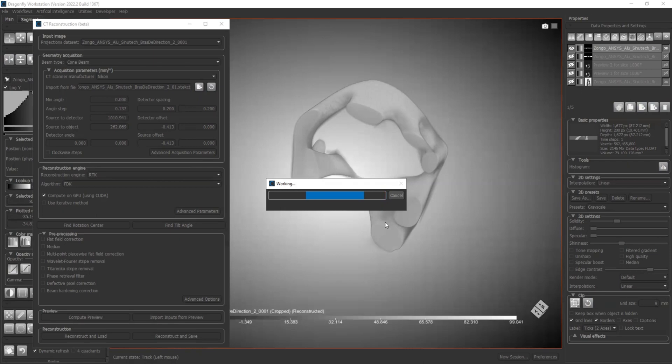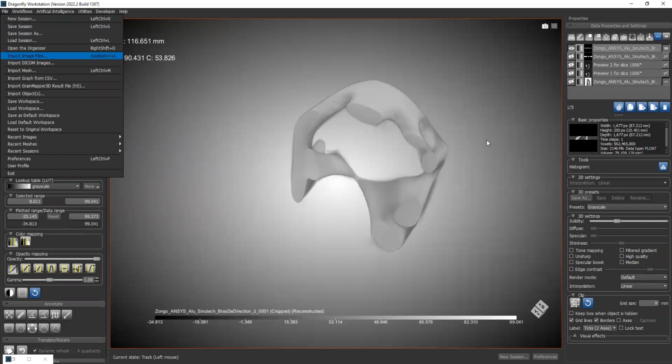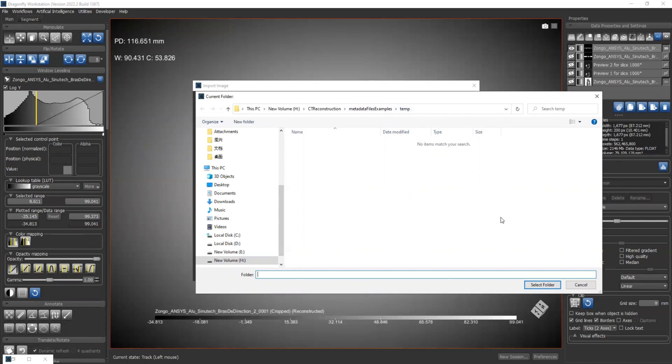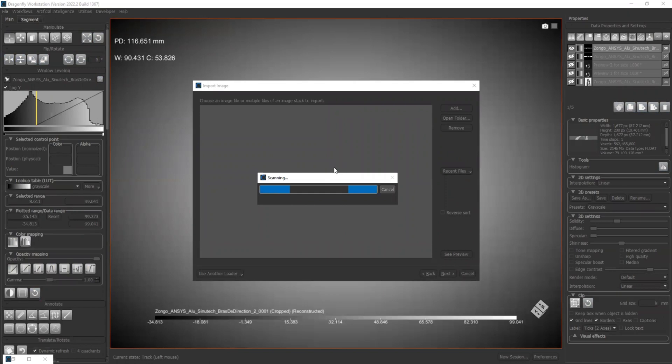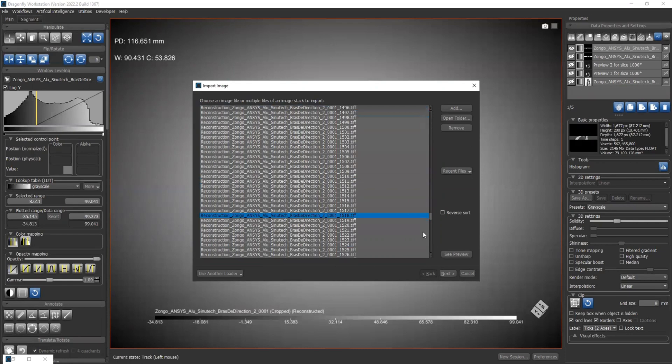And once it's done, we can use the same way as we import the projection files to import those reconstructed images. This may take some time. Okay, the reconstruction was saved. Press okay. Let's try to load it. So we have our reconstruction.